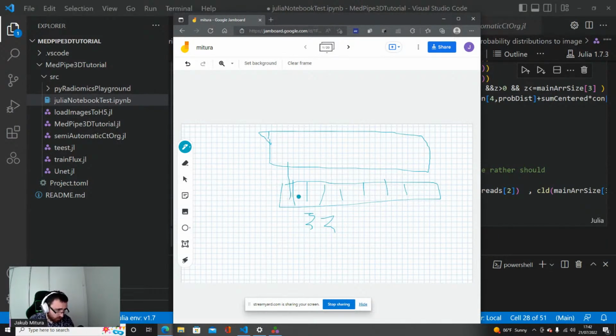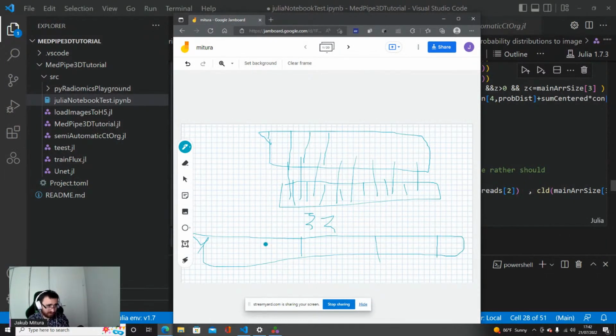And in order to get fast data loading, they should get data that is close to each other in physical memory space. Because when we have three-dimensional data, it's still a list. It's a list that has defined, by some metadata, where each dimension starts, where each layer, each column, each row starts, and where it ends. But it's still a line of numbers, basically.